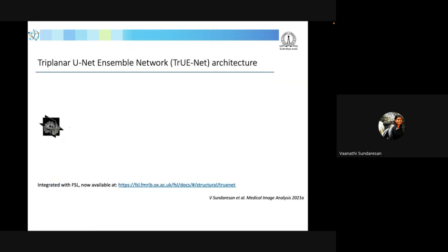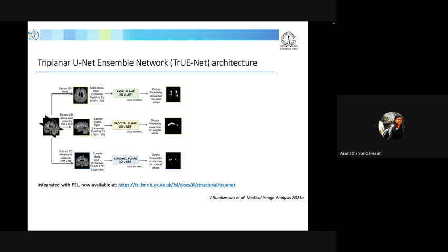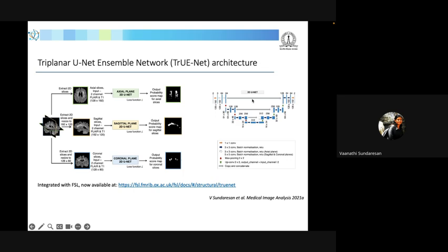So now coming to architecture. What was the model architecture that we were using? We were mainly using the UNet backbone. Here I have shown the UNet model for those who are not very familiar with it. The UNet belongs to an encoder-decoder architecture.